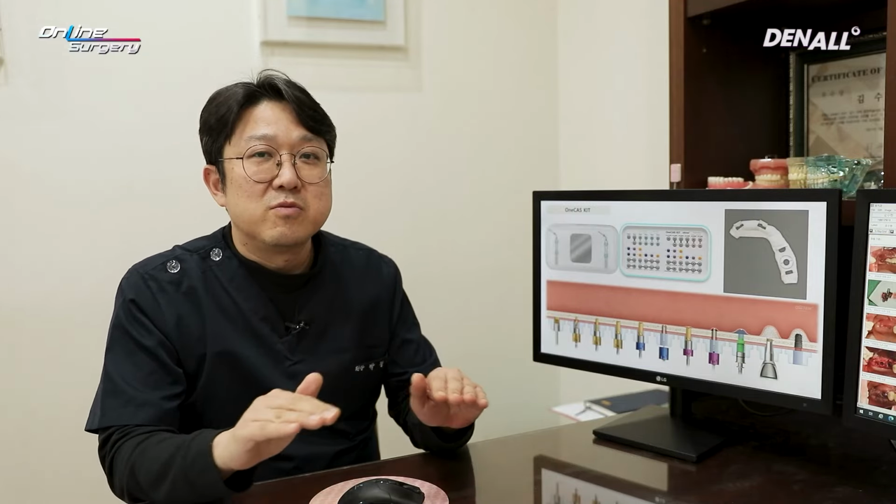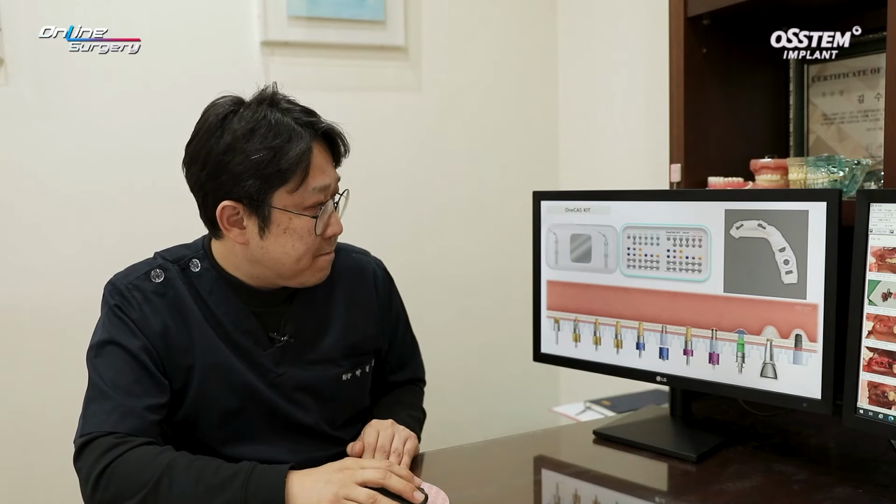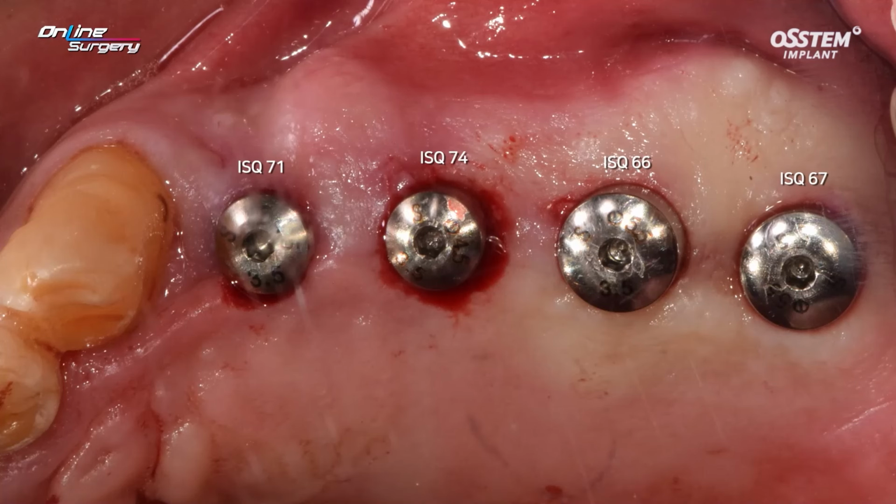In flat areas, it's not very difficult to perform surgery, but in sloped regions, there can be a bit of difficulties. If you're doing crestal approach for the first time, it is better to approach it from the flat area rather than sloped area. If you're experienced, it doesn't matter where. This is the image of how the guide was adapted. The implants were placed.